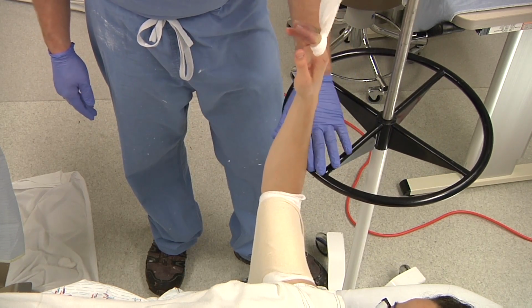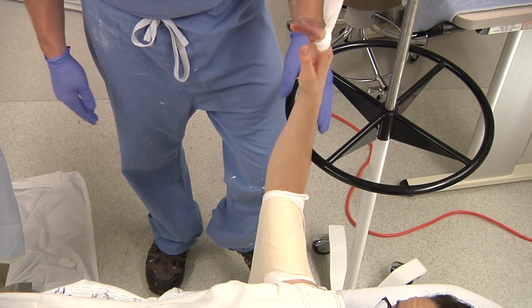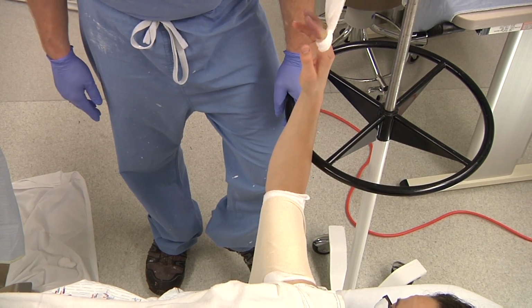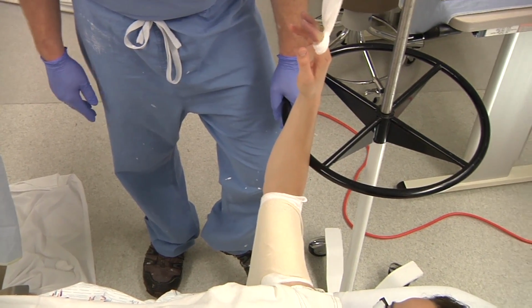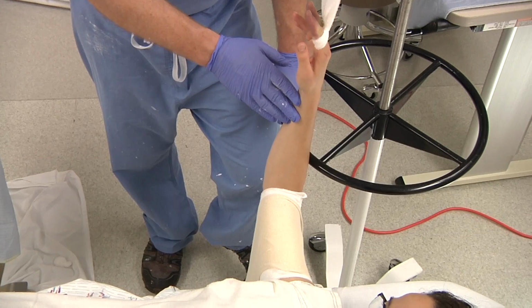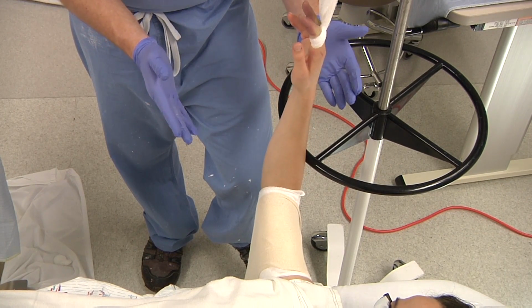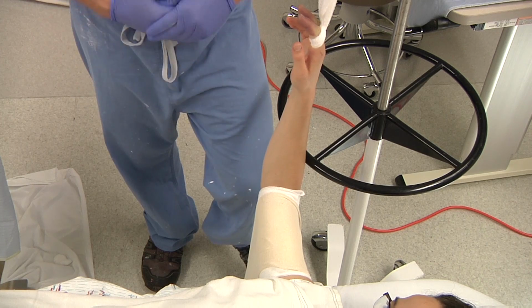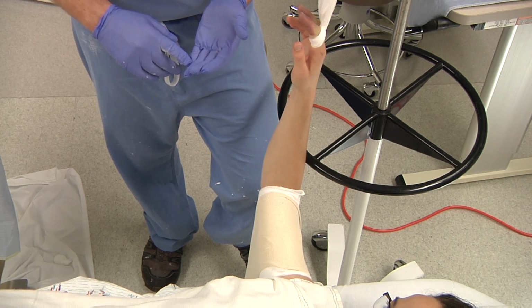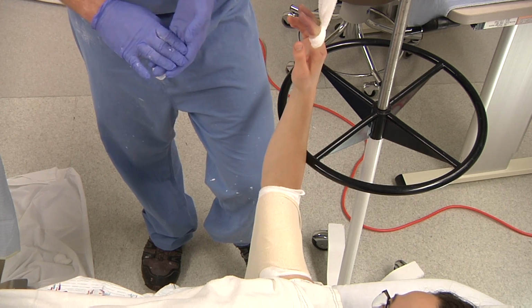You do need to be careful if you have a ring stand where it is pressing against the patient's skin. Be cognizant of that. From here, sometimes we do leave patients in traction for a period of time to allow distraction and relaxation of the muscles and the deforming forces. You can also at this time easily bring in a C-arm or a mini C-arm, check your fracture alignment to see if you have maintained an acceptable amount of length, rotation, and reduction of your fracture.